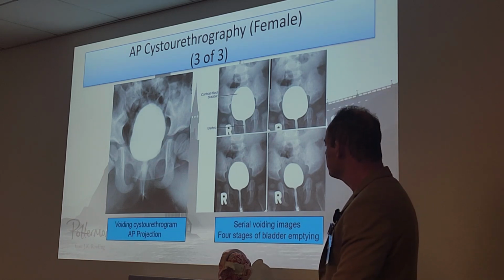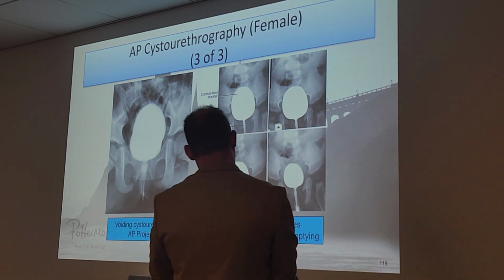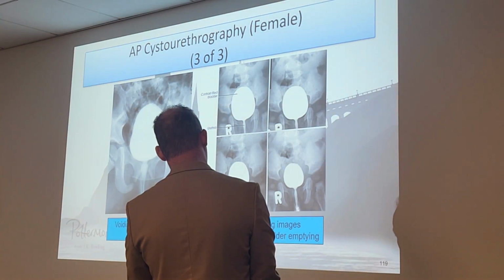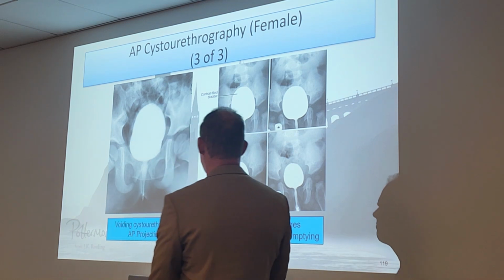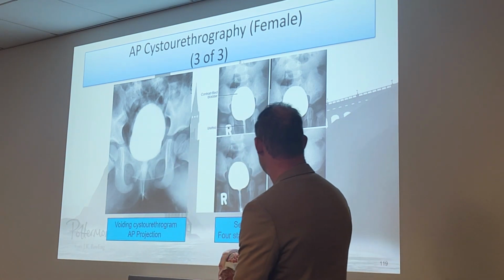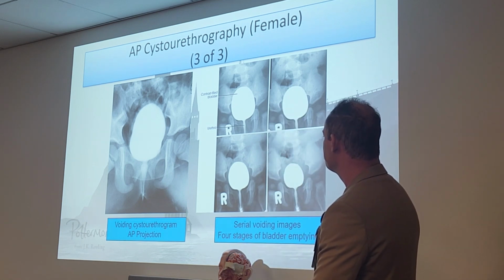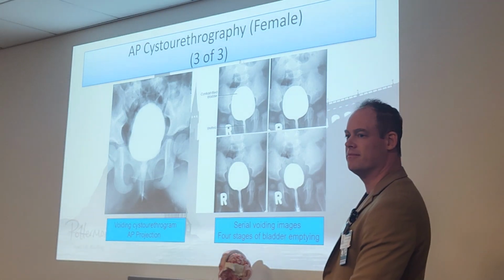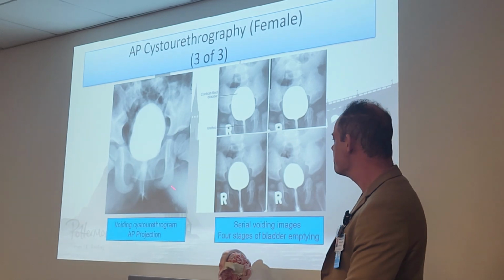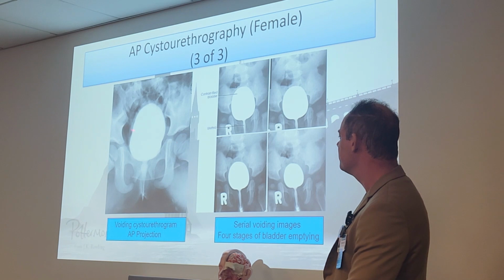Why does it look right at the very end? Right here? That's a good question. Does she have catheters? No, right? I don't know what that is. I'm not sure. I don't know. By the way, this is a pediatric. Can y'all tell? Yeah, because of the bones and stuff. The joints are super open.